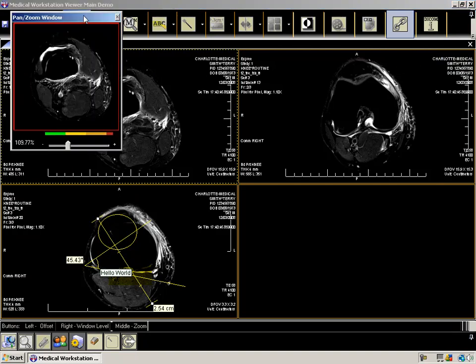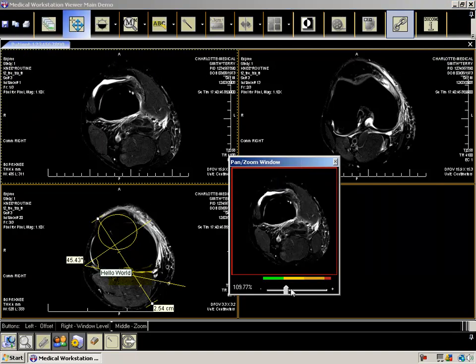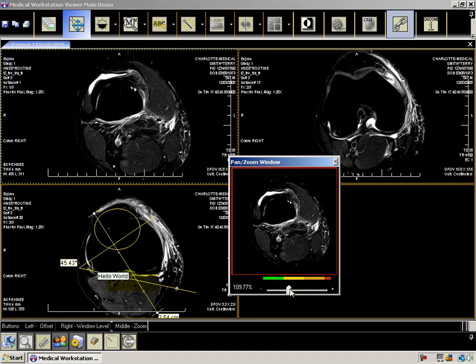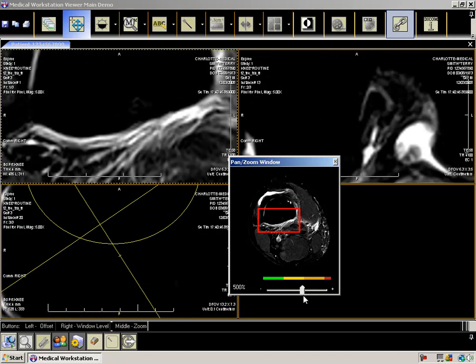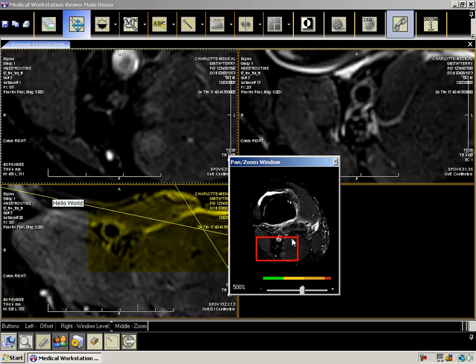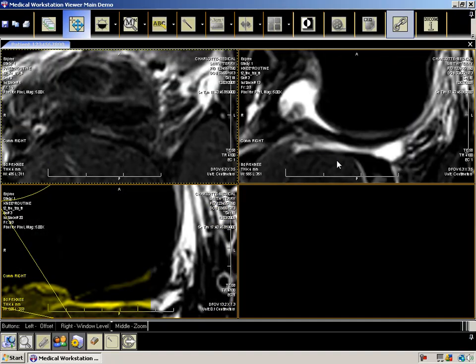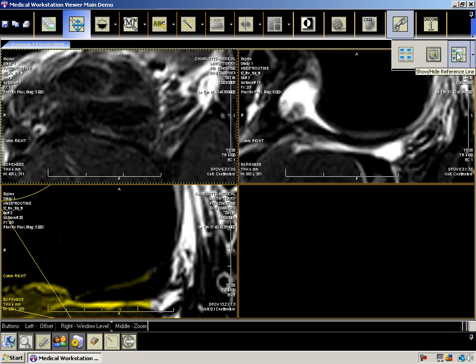Our pan zoom window allows you to quickly zoom in on the image. Once zoomed, you can move the rectangle around, which updates the display area in the sub-cell. We also support scout lines if the dataset supports them as well.